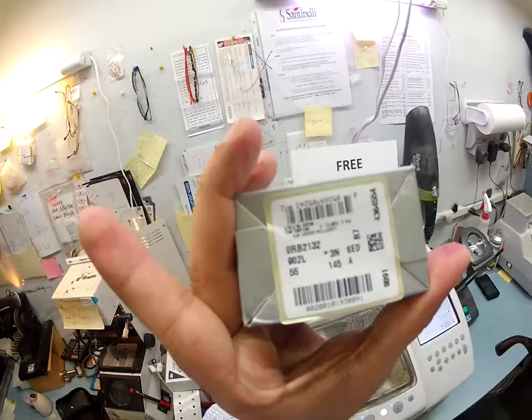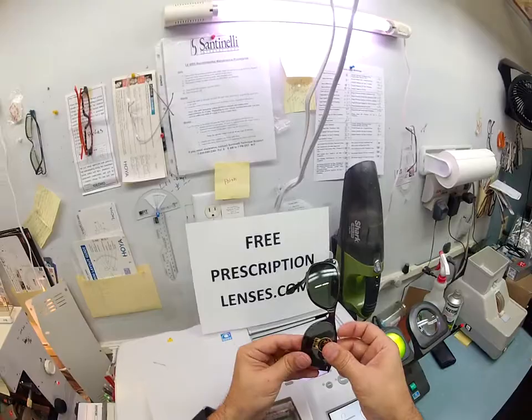Ray-Ban 21-32, size 55. The box that it came in: 21-32, size 55. So we're good to go. Now for the left lens — let's see this one be as easy. I'm going to tuck it in at the outside corner. You got lucky — I've never seen a 55 go in that easily.